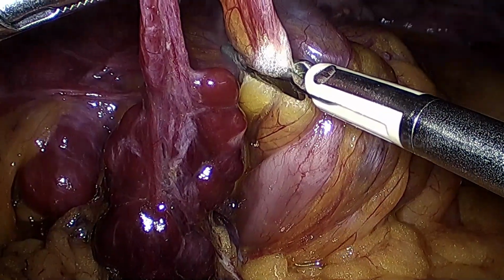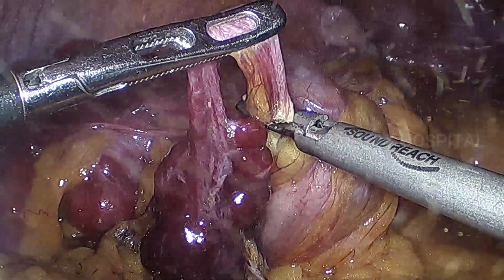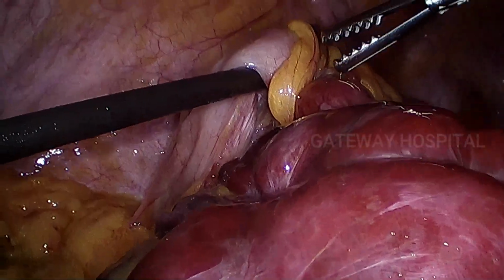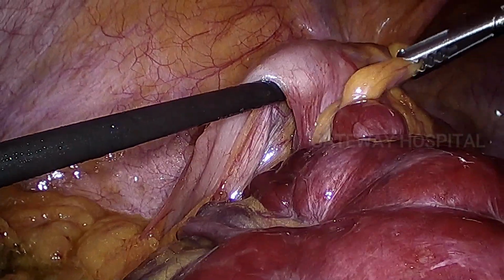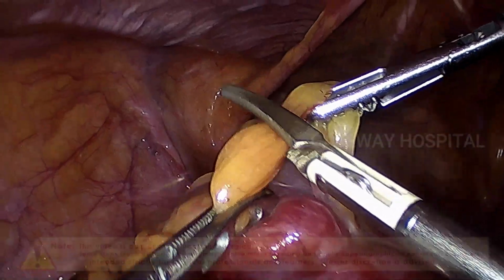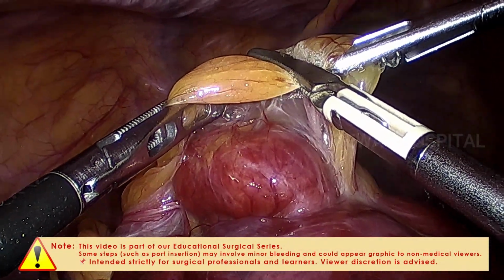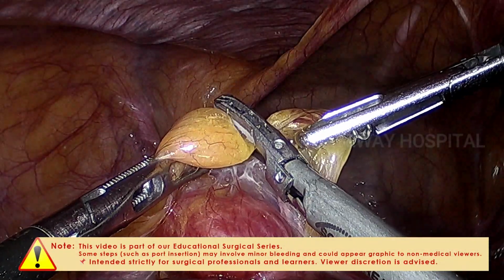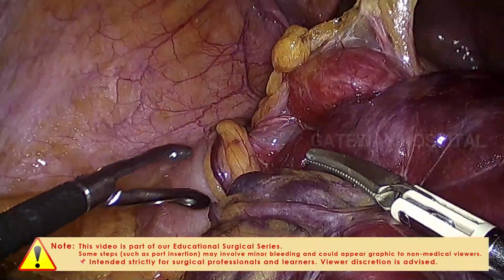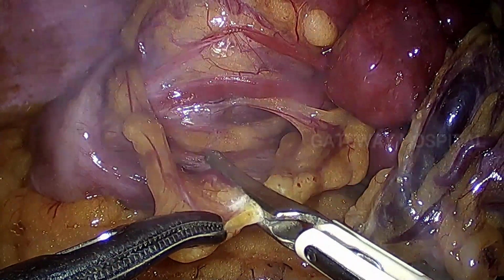After introducing the laparoscope, we could see a large tumor predominantly attached to the greater omentum. So more than 90% of its blood supply was derived from the greater omentum. It was closely related to the descending colon, and it was getting some of its blood supply from the vessels of appendices epiploicae, and these smaller vessels got enlarged because of the tumor size.